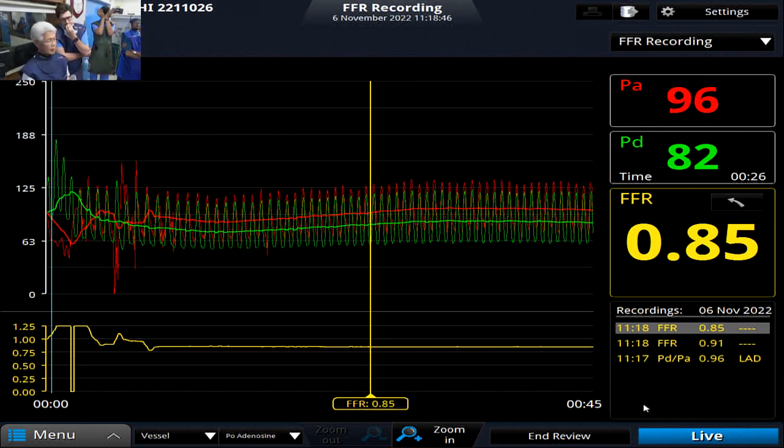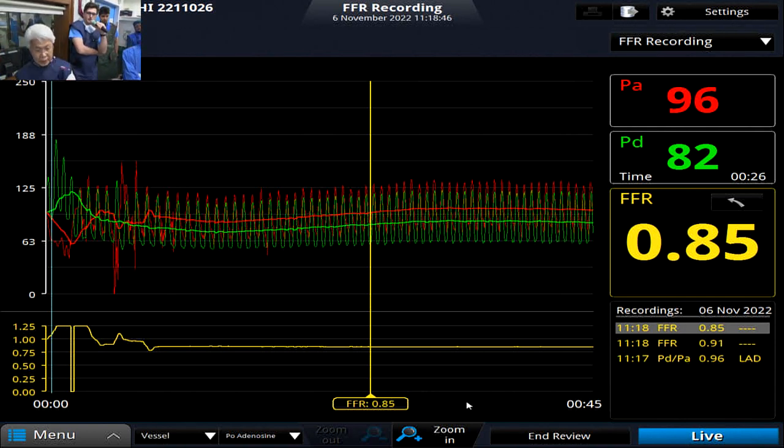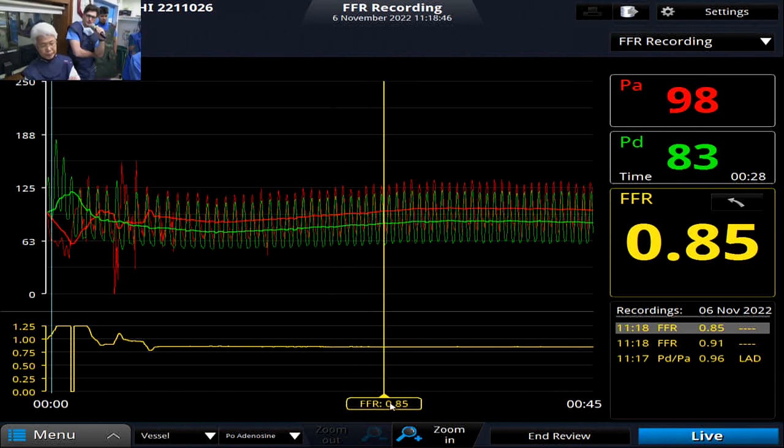But this is correct. But here you have a little bit of a summation of lesions. You have the stent, distal to the stent, proximal to the stent, then you have the ostial LAD. So I think this is where pullback comes in handy. But many times I do the pullback and you see a progressive change, you don't see a distinct step up. When you see a distinct step up, that makes things a lot easier. But many times it is just diffuse disease.